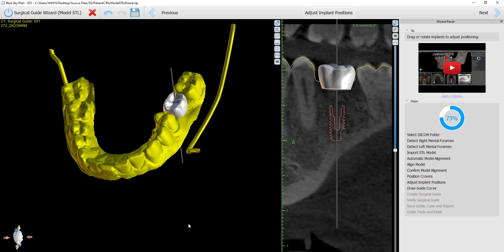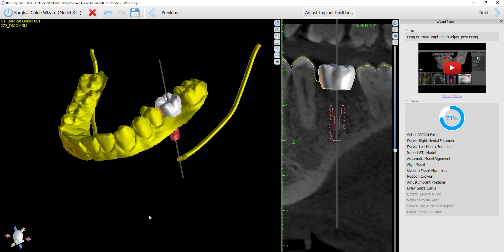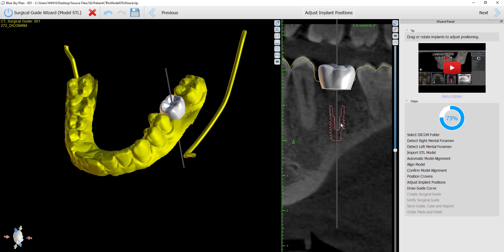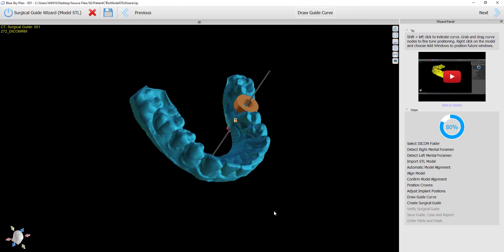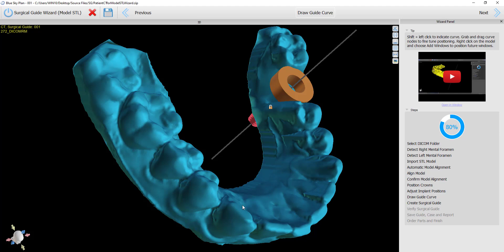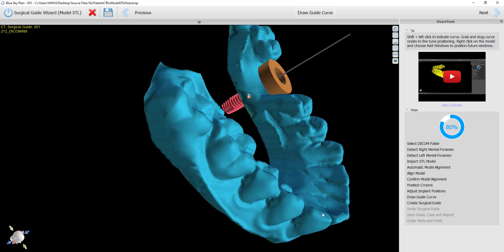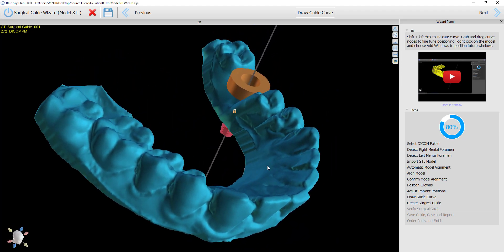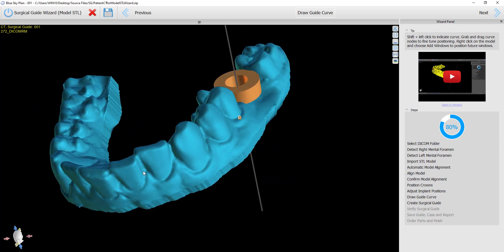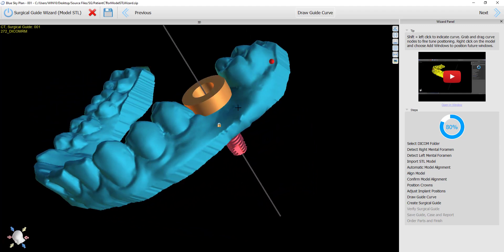Let's take a look at the wizard process. After the user has imported the model, placed the implant, positioned the crown, they go ahead and click on next to get to the step to draw the surgical guide curve. The software fabricates the undercut model — this step happens automatically and the user does not need to do anything different. We are now looking at the model with the undercuts removed. As mentioned earlier, the undercuts have been removed at a 30-degree angle.